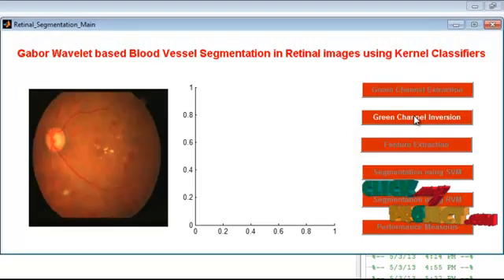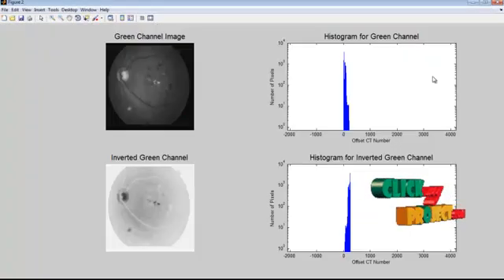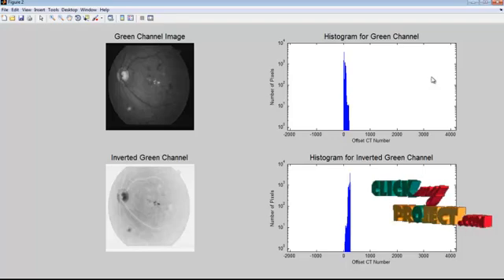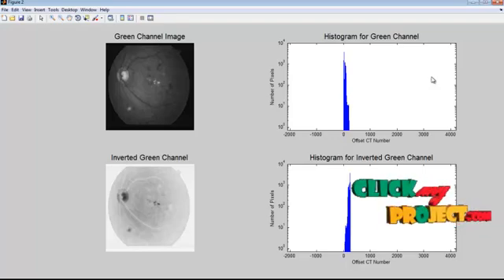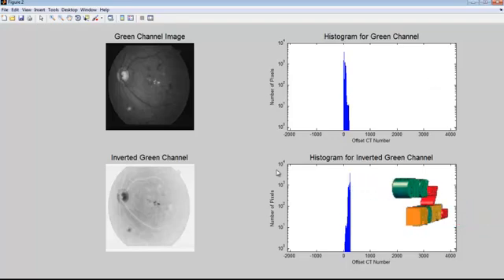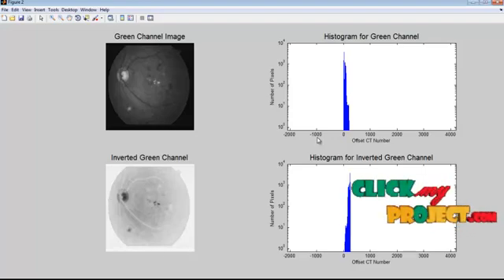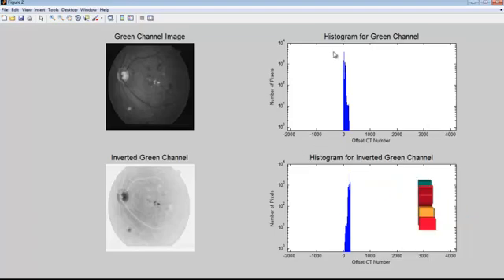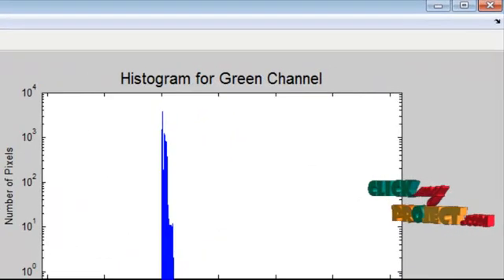Next, we apply green channel inversion before application to the wavelet transform, so that the vessels appear brighter than the background. This also shows the corresponding histogram for the green channel and the inverted green channel.